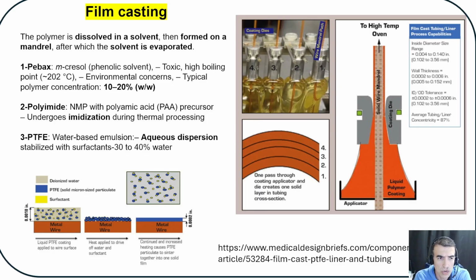So these particles now are close to each other and they get connected through van der Waals forces. Now you heat them more, and as you heat it more, a process starts that is called sintering. Sintering is that you diffuse all these particles together to form a solid layer. Basically, you're creating a very, very solid thickness on the surface.